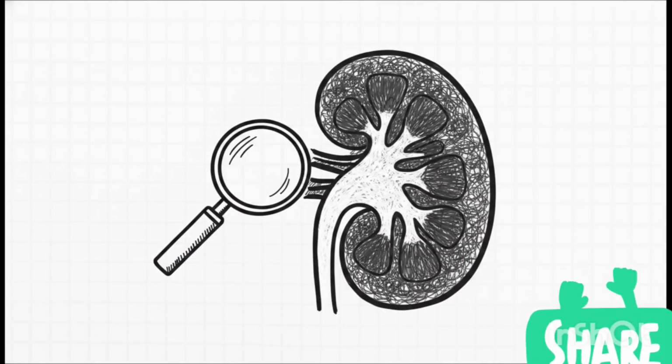All right, let's break down the visual language of the organ itself. On a healthy ultrasound, the outer layer, the cortex, appears slightly darker than the nearby liver or spleen. In stark contrast, the inner area, which is known as the renal sinus, is very bright. This brightness is just due to the echoes bouncing off the fat and the collecting system inside the sinus.